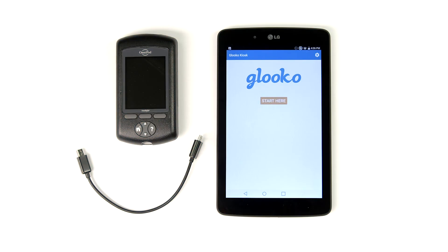Hey there, welcome to Glooko. Today I'm going to show you how to sync an Insulet Omnipod PDM with Glooko Kiosk at your clinic.